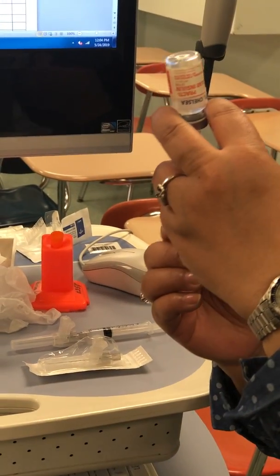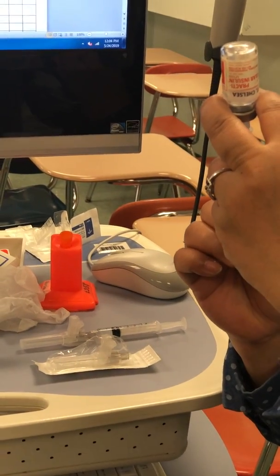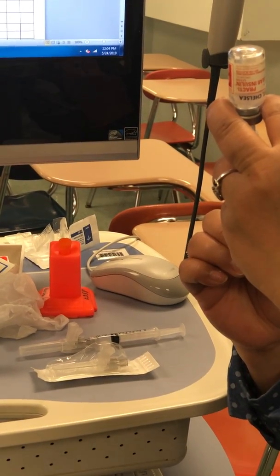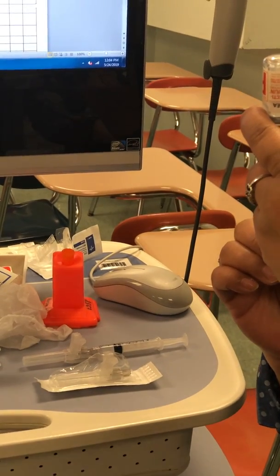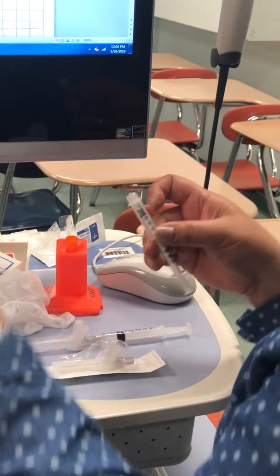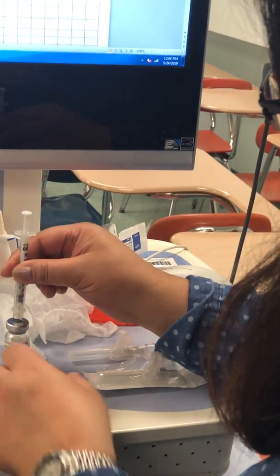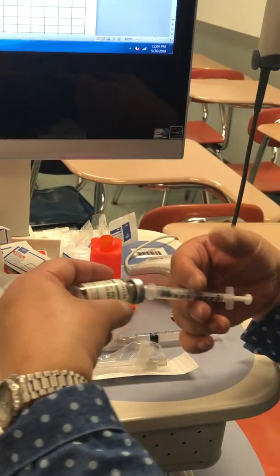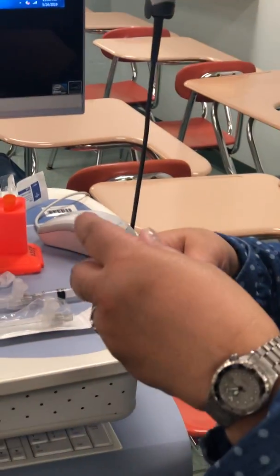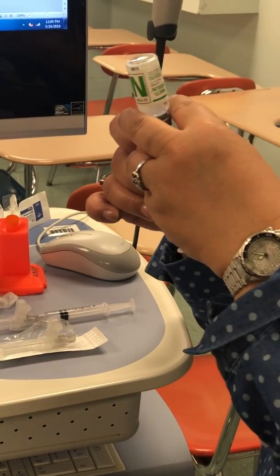All right, so we're gonna get like 10 units. I do keep on saying ml. 10 units, all right? And then we're gonna go over here. See, you have to always watch out for the needle, all right?